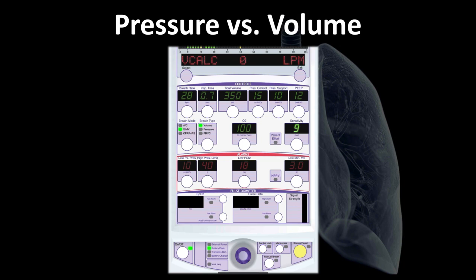That's just me. If I'm using a ventilator like the Revel in this patient, I'm probably in this type of patient going to go to a volume breath. I think it gives us a few advantages. And I think it's a little bit more simple in this type of patient.